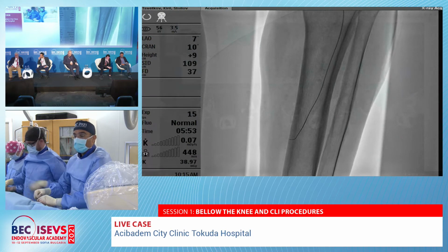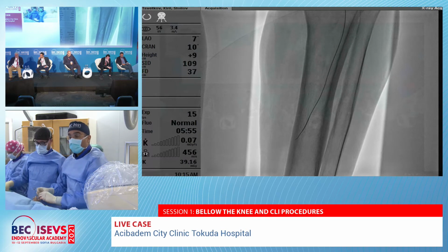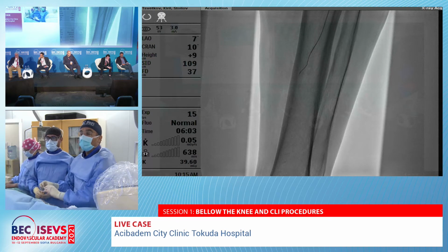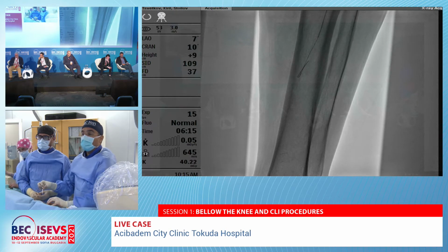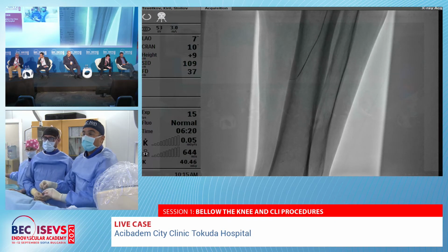This is an 018 wire. It's not the best thing. Let's go here. Here's probably collateral. Yes, it's going to a side branch. Let's go back. That is better. Okay, let's go up to that level.